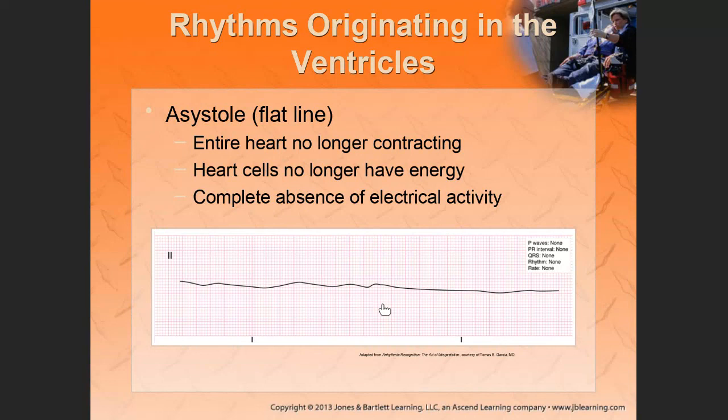No pulse is present. What's the next thing? We need to check the leads. So we need to check to see if the leads are properly attached to the patient. Leads are properly attached. So leads are good. What's the next thing we need to check? We have checked the pulse.